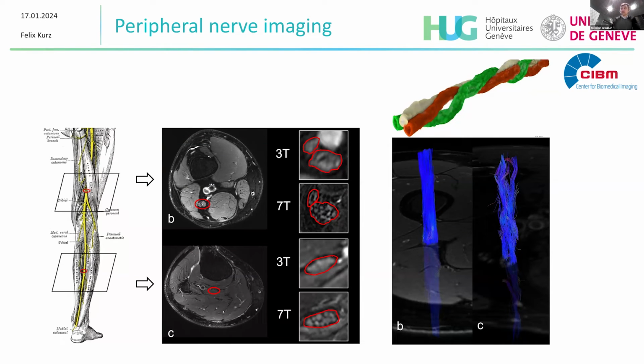But still, you can manage using parallel imaging techniques, and you can compare 3T and 7T images at high field strength. In this case, this gives the impression that you see much better the neural structures also in normal peripheral nerve. So I think in this case it has very, very good advantages. And the images I saw here with the new generation of 7T are spectacular. So I really hope that we can see more of this.